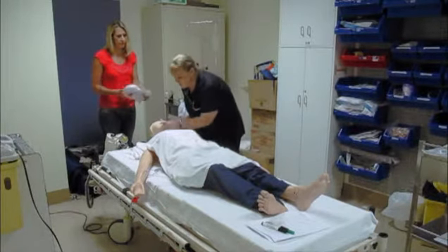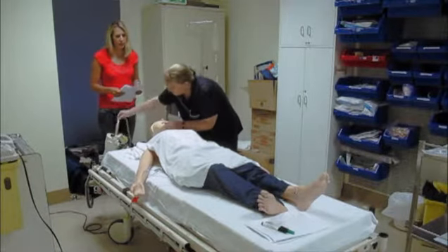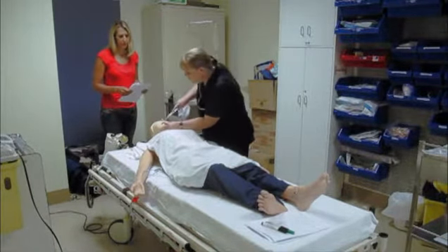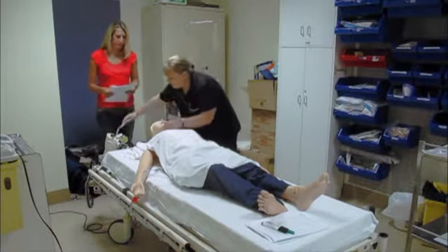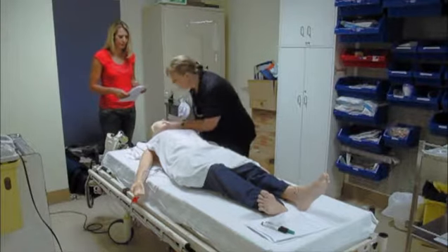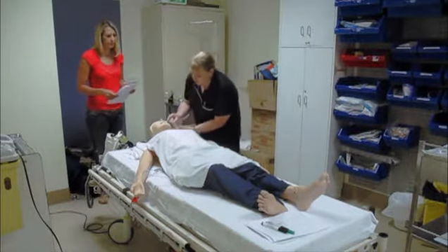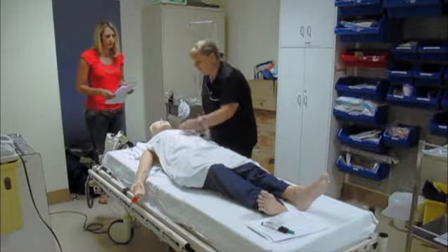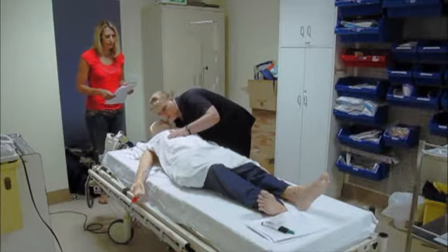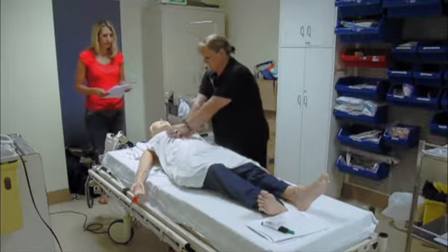I am now going to check his airway. There seems to be some vomit in and around the mouth. I'm going to do some suction. It appears clear. It is now clear. I'm going to pop in a Guedel's, and I measure the Guedel's from the angle of the jaw to the corner of the lip. Insert and twist. I'm now going to check for breathing. I'm going to look, listen and feel. There is no rise and fall of the chest. I'm going to now start compressions.